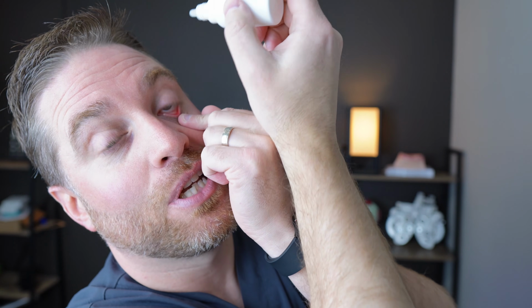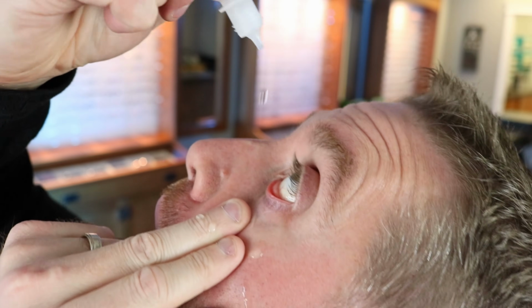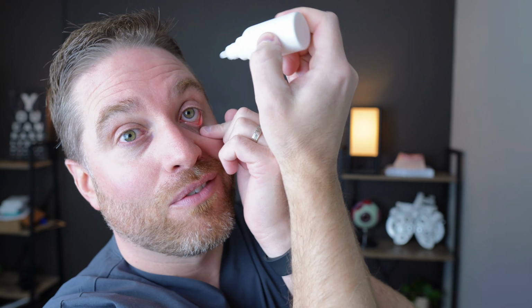Now your non-dominant hand is also going to serve another purpose. It's going to serve as the balancing hand. So when you take your dominant hand with the eye drop, you're going to rest it right onto your non-dominant hand, and that keeps your dominant hand nice and balanced. And this is nice because if you're a little shaky and maybe holding the eye drop and you tend to miss a lot, this can help balance it so you have a little bit more control.